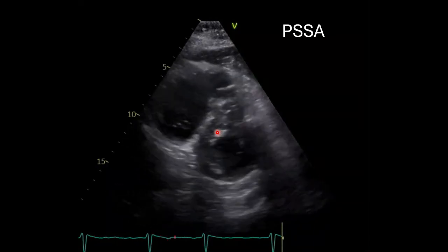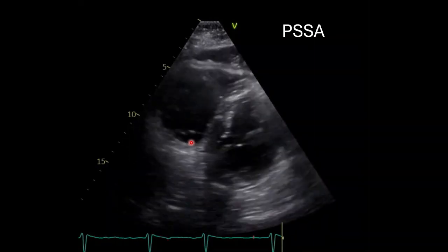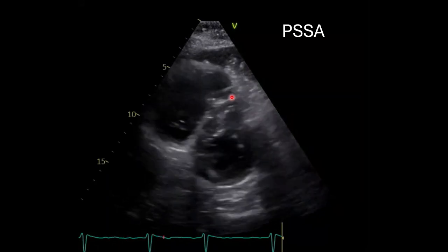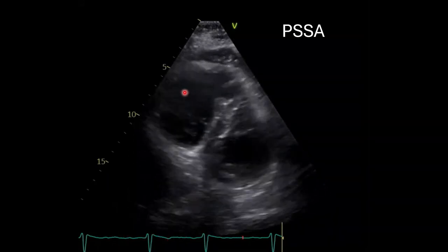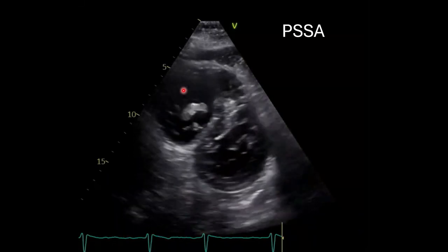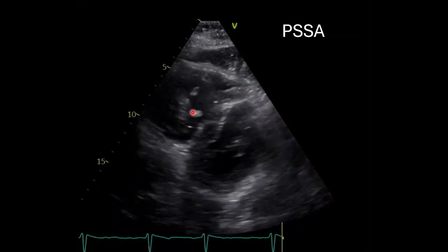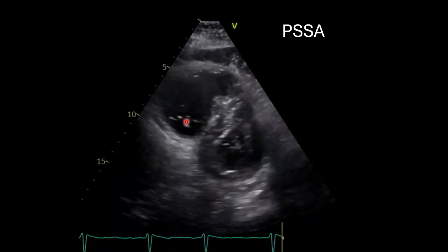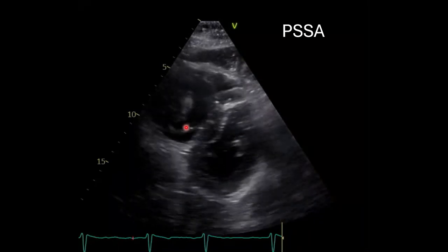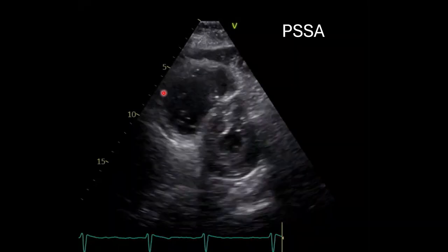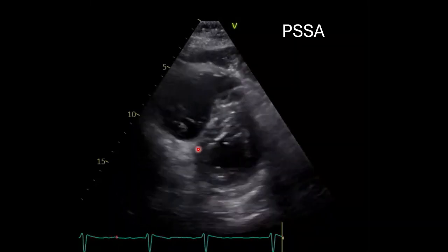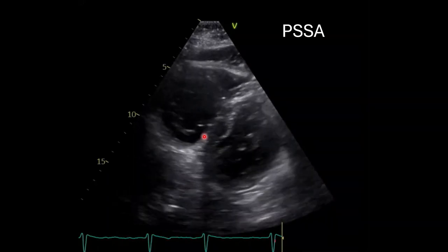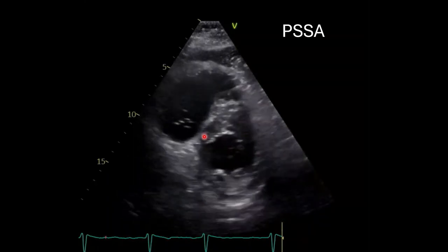On the parasternal short axis view, you'll notice again in the right ventricle there's an echogenic mass that appears in some parts of the clip. The RV appears a little bit enlarged, and there's some flattening of the interventricular septum as well.